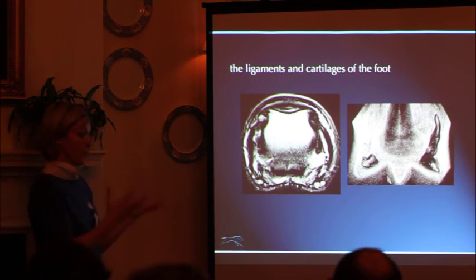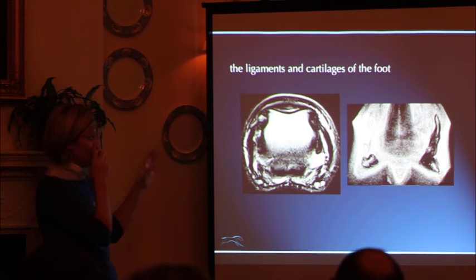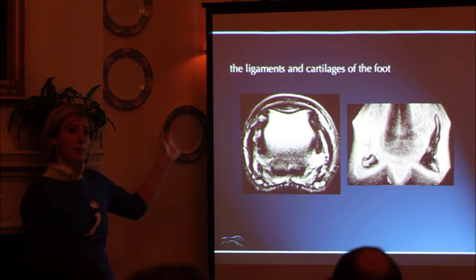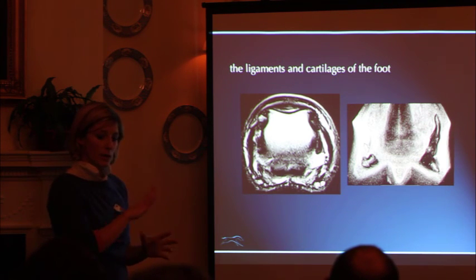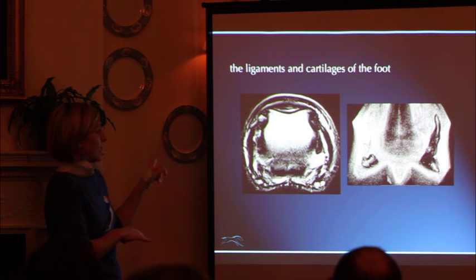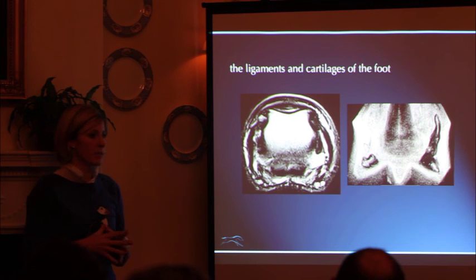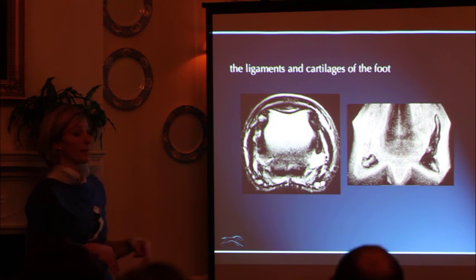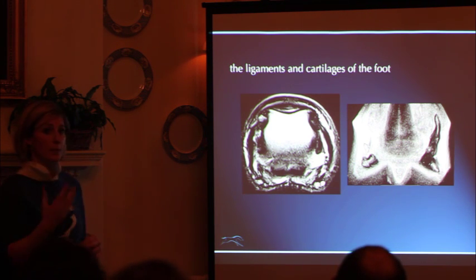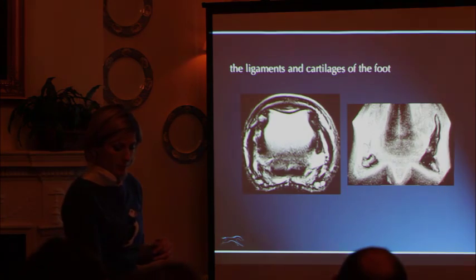They're often all involved. So they're the types of quite complicated horses which we do struggle with when they start getting combinations of ligament injuries and collateral cartilage injuries. They can be difficult to get sound. And it tricks us really, because on an X-ray you just see a bit of side bone and you think, well, that's not very exciting, let's send it for an MRI scan, and then we come back to you and say, well, actually the side bone is relevant, but not just the side bone, but all those ligaments that support that area.